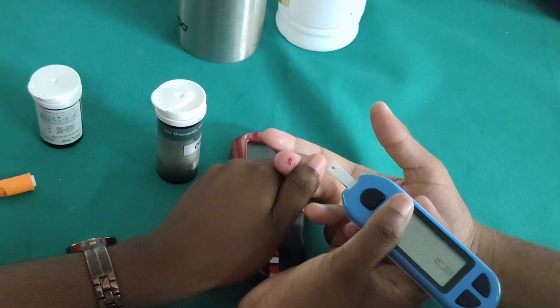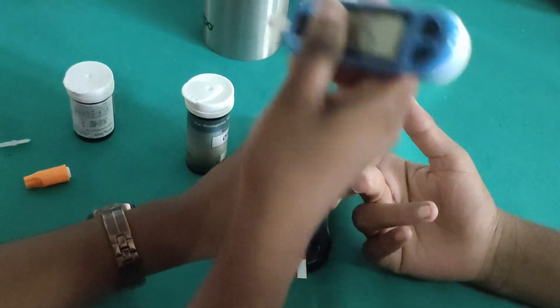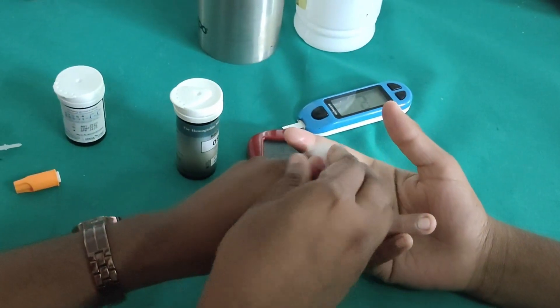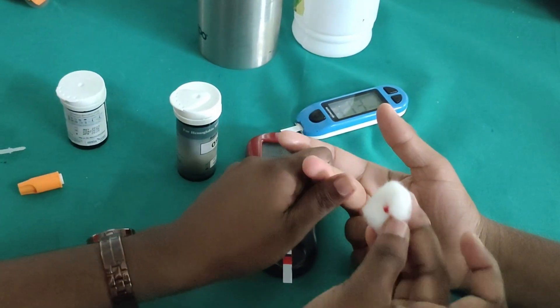The first drop is serum, so that is why you have to discard it when checking for RBS. We are going to clean that drop, then we are going to take the third droplet.